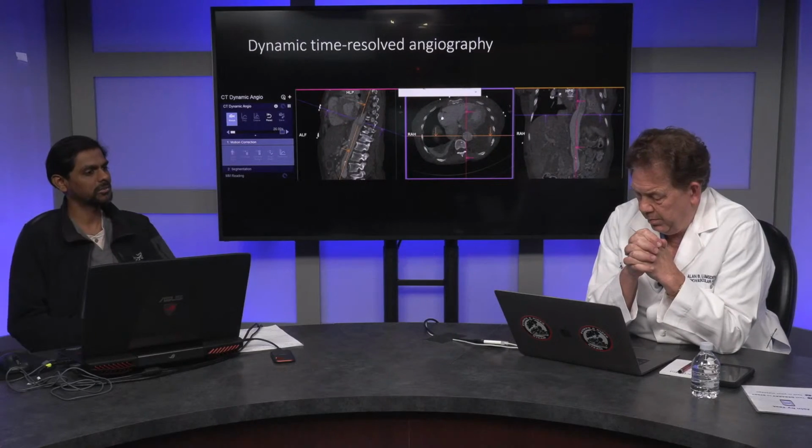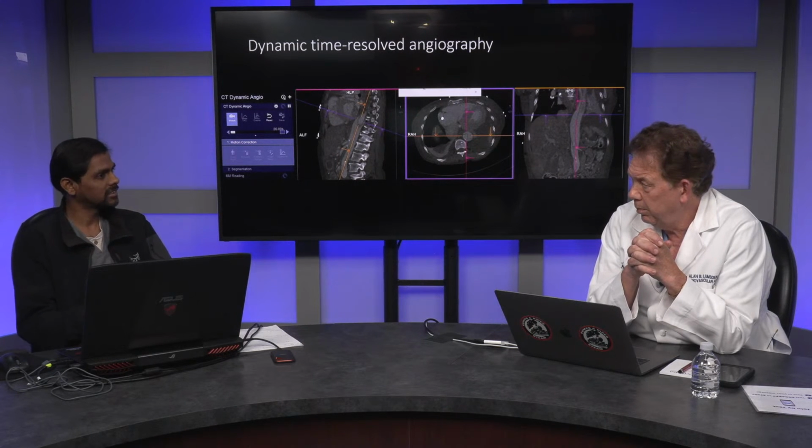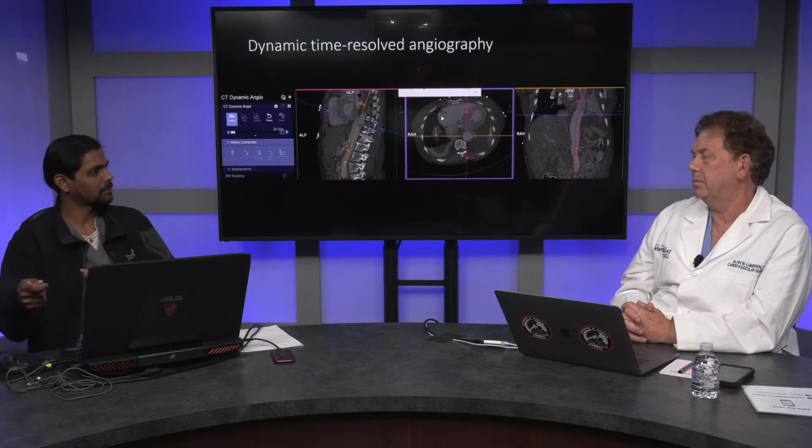It's tailoring the menu or the recipe for doing the CAT scan to answer the question. And that means you've got to be engaged in it and have a certain amount of influence to be able to do that. So there are two ways we can make this strategic imaging happen. One, you can approach this from a technology standpoint. We can make our protocols easier to use or fool proof, where, for example, when you're ordering a CT, you could answer a bunch of questions and then that can be converted into a protocol and goes into the scanner.